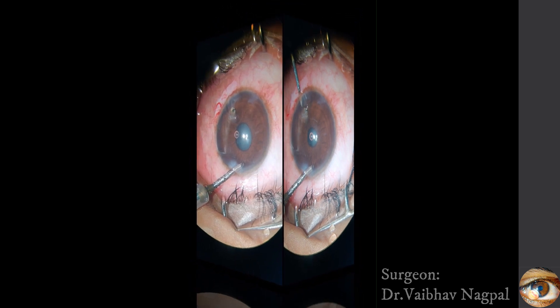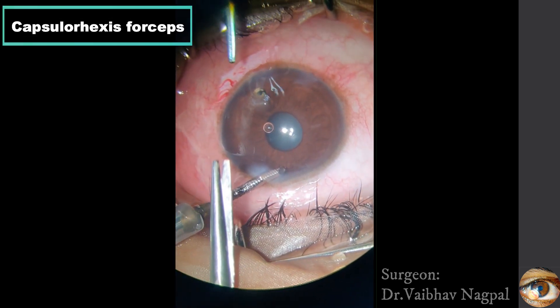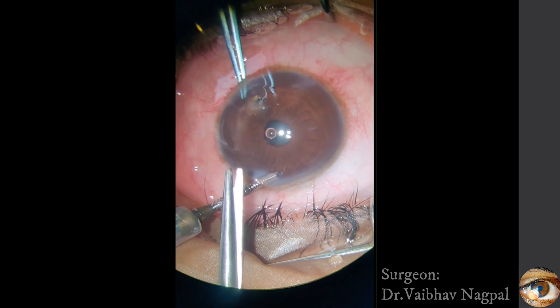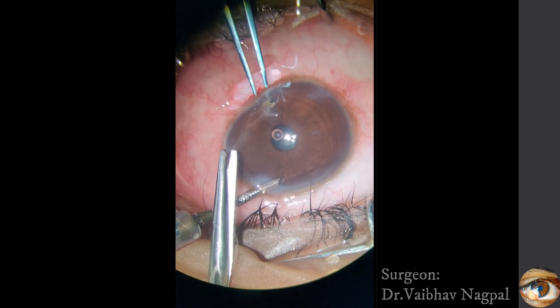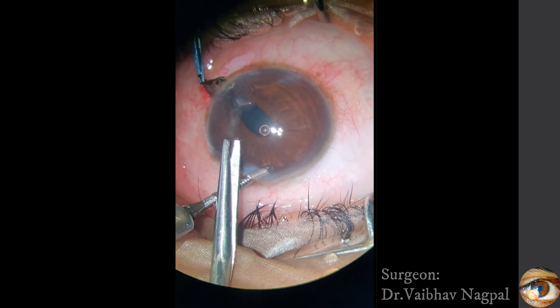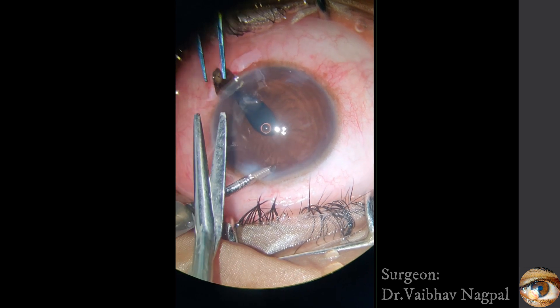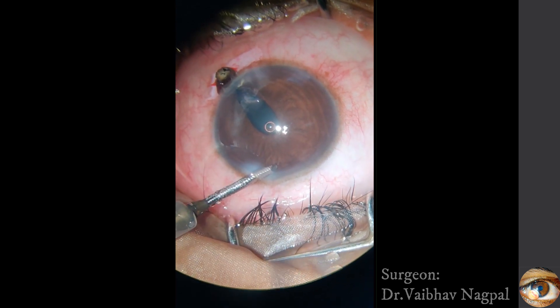After the failed attempt with the repositor, the iris tissue is prolapsed along with the foreign body using forceps. The foreign body and the adherent iris tissue are then abscised.